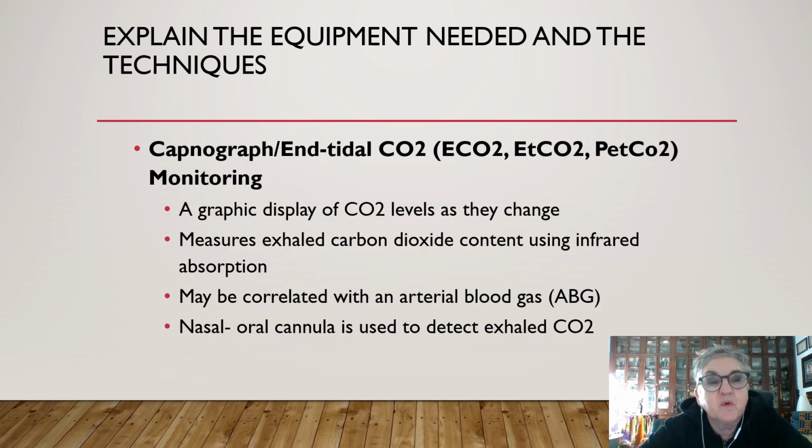The next piece of respiratory monitoring equipment is the capnograph, or end-tidal CO2 monitoring. It's a graphic display of CO2 levels as they change breath by breath. It measures exhaled carbon dioxide content by using infrared absorption. It may be correlated with an arterial blood gas, and a nasal oral cannula can be used to detect exhaled CO2.